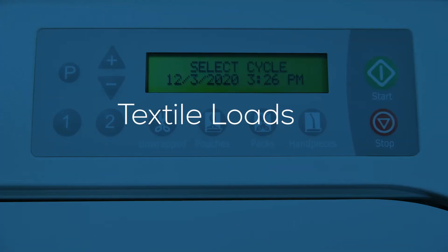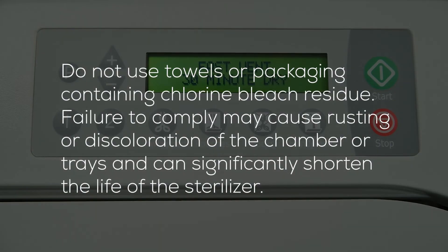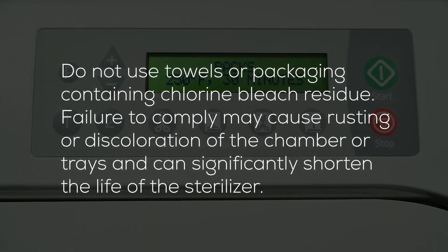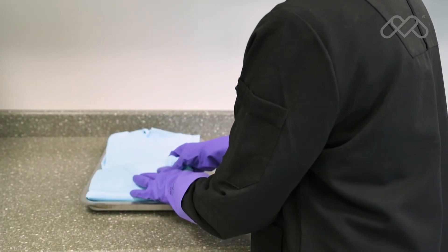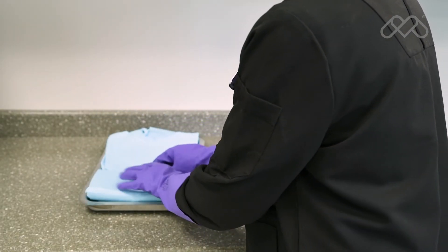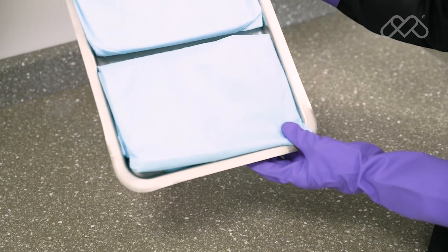Clean textiles recommended for steam sterilization can be processed in the pack cycle. Verify the acceptability of the pack cycle sterilization parameters with the textile manufacturer. All textile packs must not exceed the thickness limits specified in the maximum capacities tables in the user guide and must fit within the boundaries of the sterilizer trays. If multiple packs are placed on a single tray, maintain a minimum of a quarter inch between packs for proper steam circulation and drying.